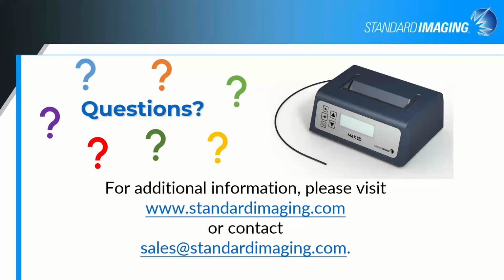There's a question about the yellowing of the plastic fiber. How can it be mitigated? It really can't. It's just something that you have to be aware of. The more dose you give the fiber, the more it turns yellow. I think we've all seen really old PMMA plastic phantoms or slabs that have yellowed with age. I think it's 2% signal magnitude for about every kilogray of dose that's delivered. So it is a relatively slow degradation, but it does happen.